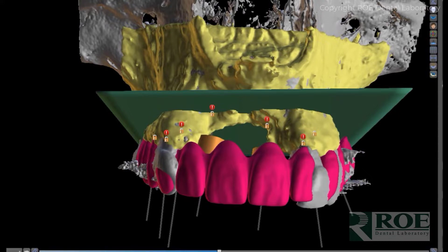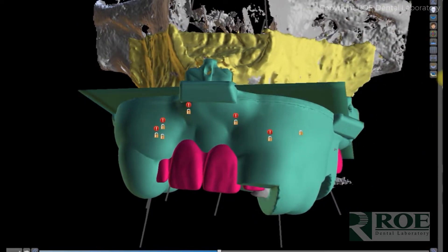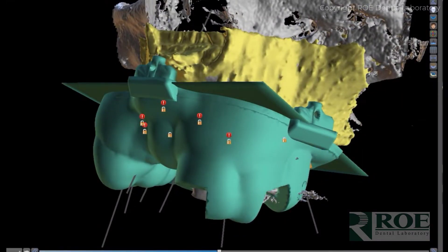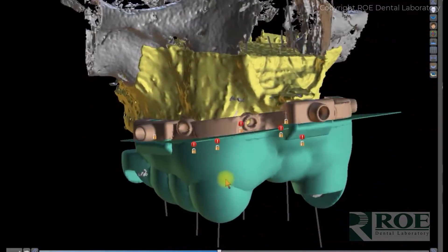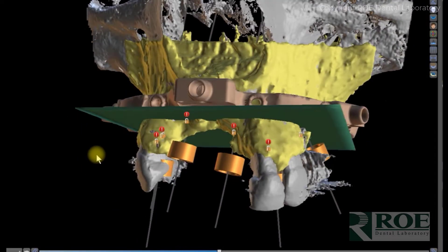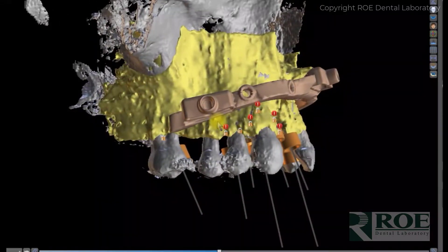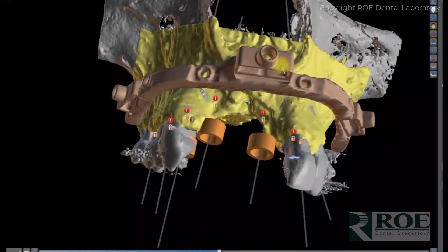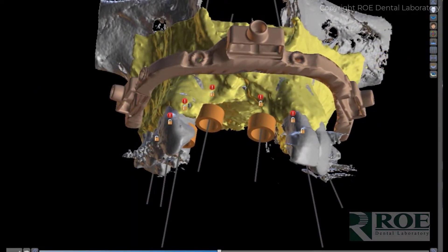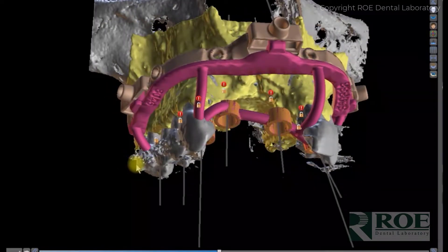Step one is the pin guide — that is what holds the fixation base in place. The pin guide delivers the fixation base just like all Chrome cases, and then the pin guide is removed along with the wafer, and the fixation base is seated.